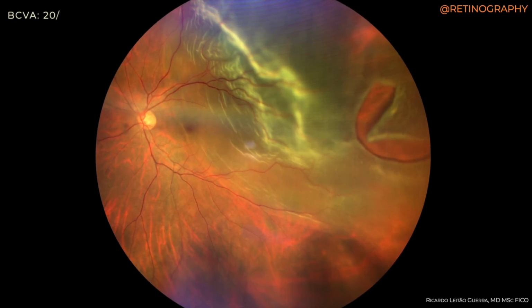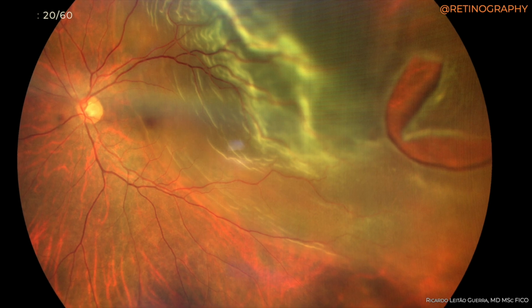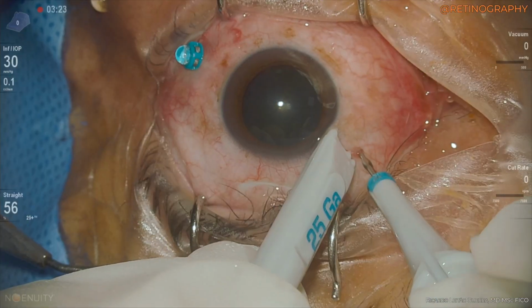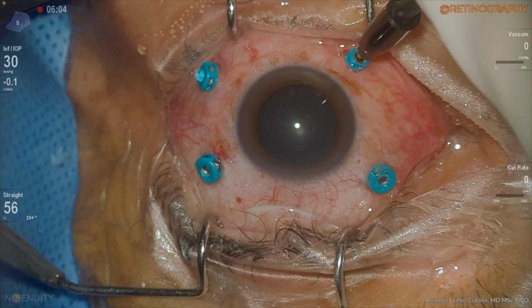In this case shared by Dr. Ricardo Leitão Guerra from Salvador, Brazil, a patient presented with a retinal detachment recently involving the macula, associated with a single superior temporal horseshoe tear. The patient had a visual acuity of 20/60ths at this time, and a primary pars plana vitrectomy was planned.